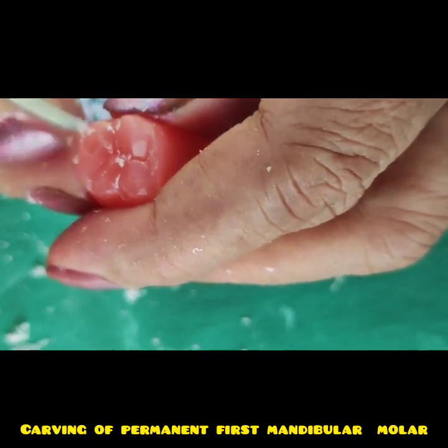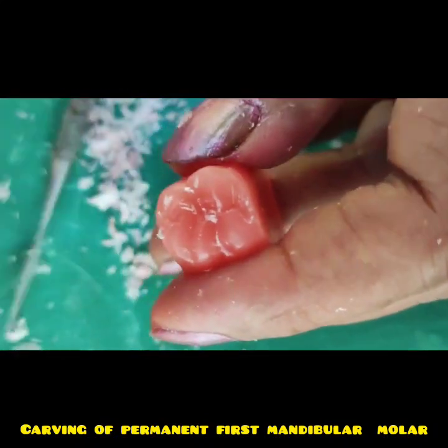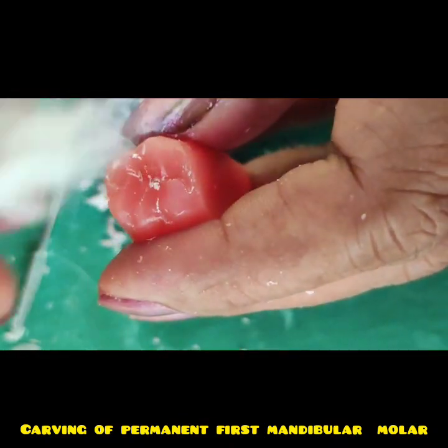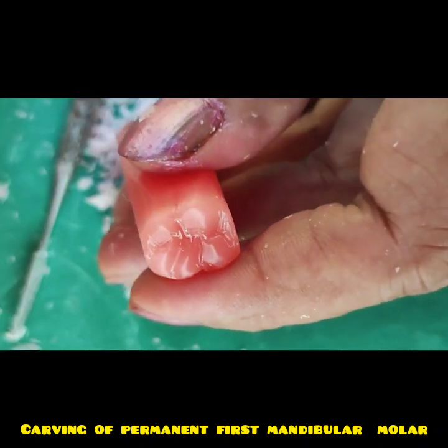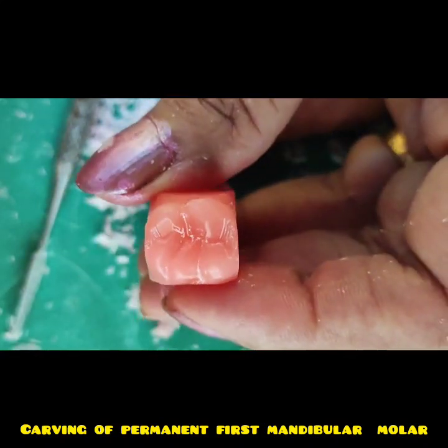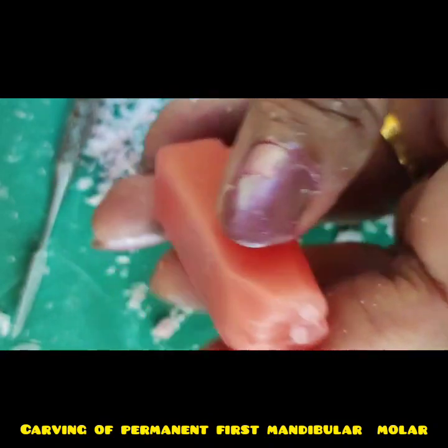Even the marginal ridges are prominent. Don't forget to carve the marginal ridges and give little pressure for smoothing. So this is how the occlusal surface of the mandibular permanent first molar is done.